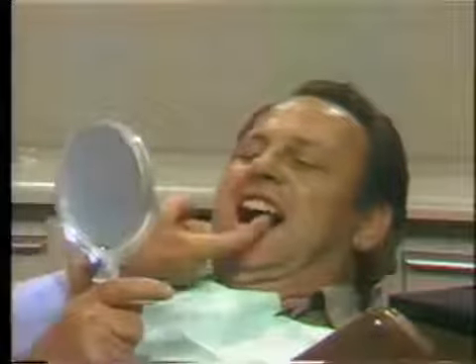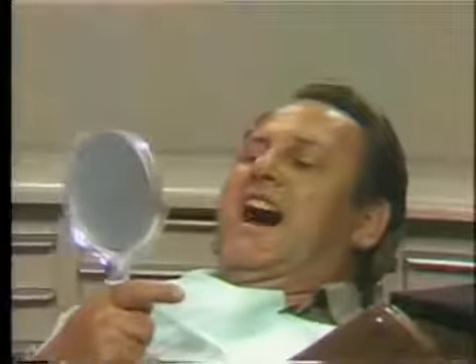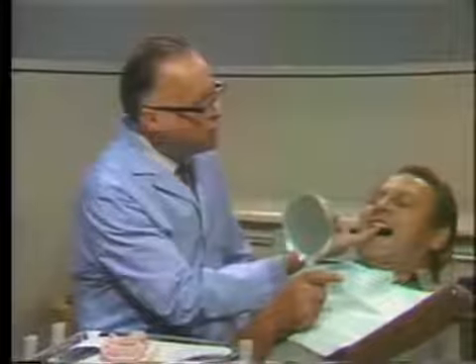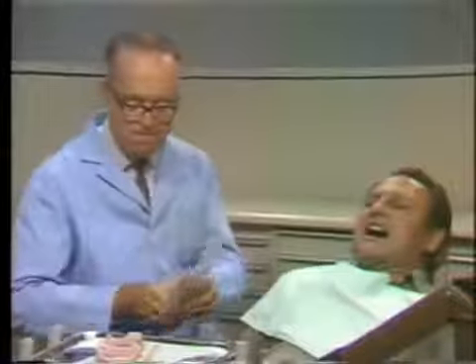You can see that there are several possible positions for that. We tried to blend it into the adjacent teeth. It's not quite the same relationship as the tooth on the other side, maybe, but it seems to us as though it would blend in quite nicely. Another thing is that we want to keep the maximum amount of room on the tongue side here for your lower teeth to come up into relationship with that, so that you won't be able to close together at the moment because of the attachment on the back of that. So you think that would be all right so far as you're concerned? Yes, looks nice. Good, fine.